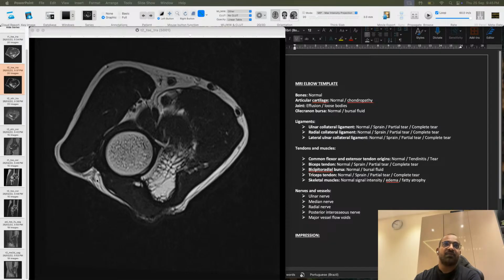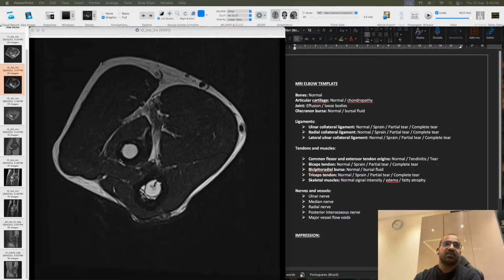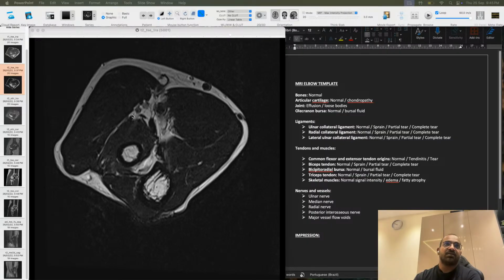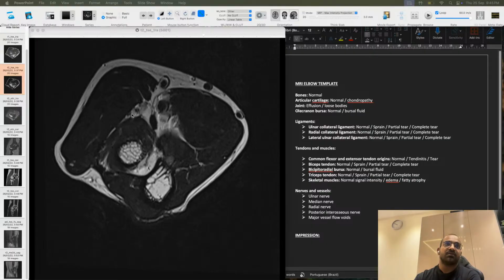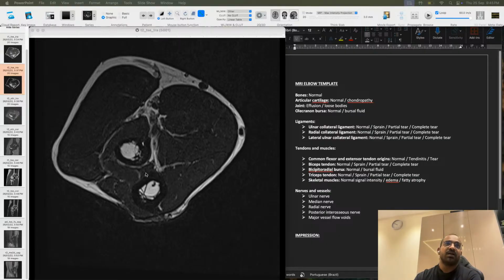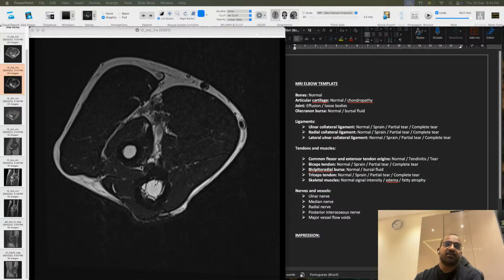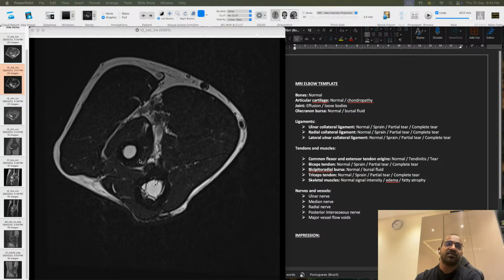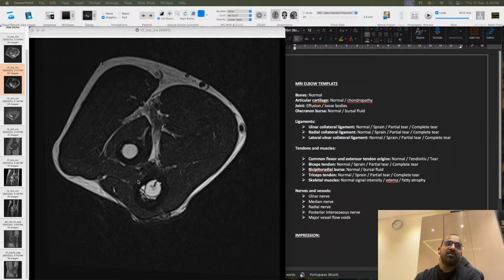and goes. If I'm taking bit lower sections, I can see. So the radial nerve will pierce the, here you can see. If you see this now, radial nerve will pierce the supinator, and the radial nerve gives posterior interosseous nerve branch. The posterior interosseous nerve pierces the supinator and goes into the interosseous membrane. This is the posterior. Here we have posterior interosseous nerve.